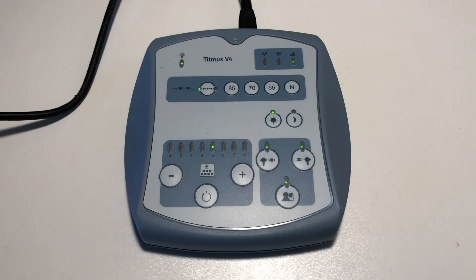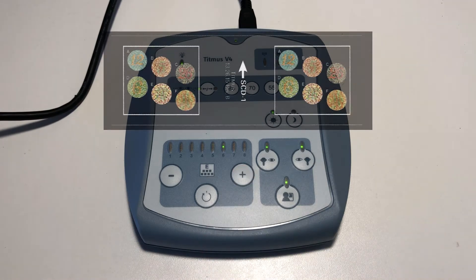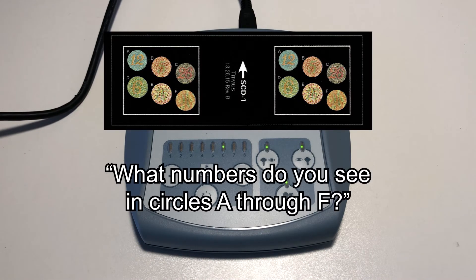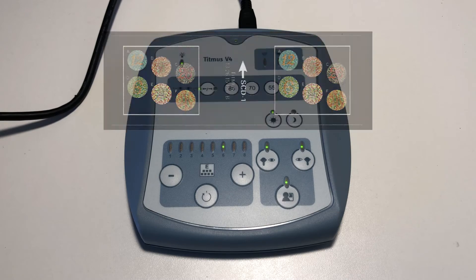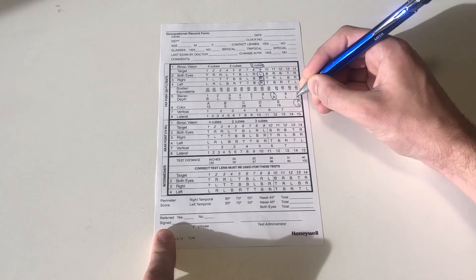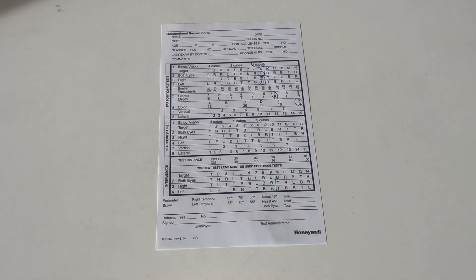Advance to slide number 6. This slide tests for red-green color perception. Say to the patient: read me the numbers you see in circles A through F. Circle the last correct answer given on the record form. Note that circle F is unintelligible.